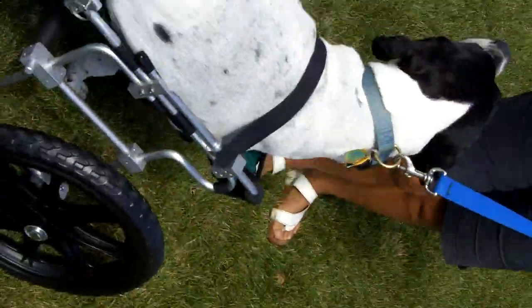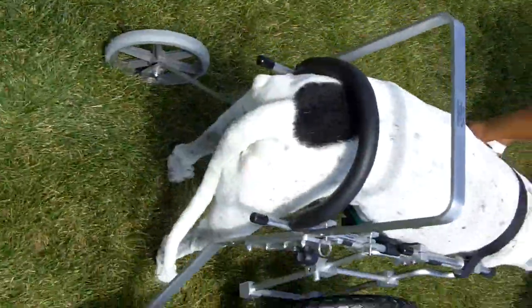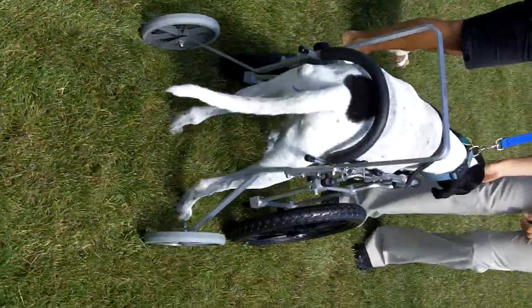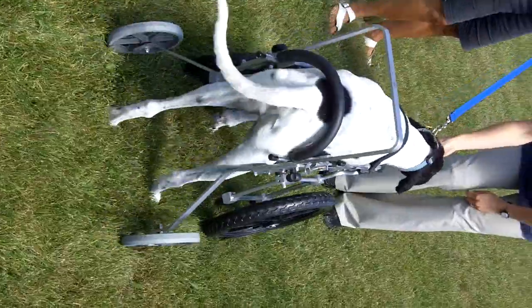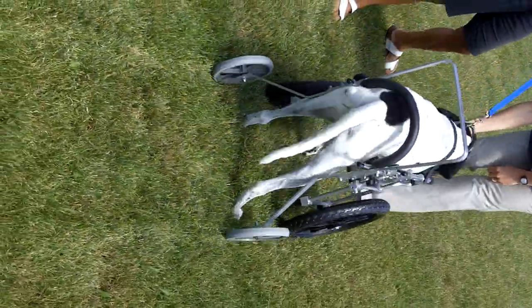And do you have a treat? Yes. So if you take the video from the rear — Chevy! Come on, Chevy. There we go. Good boy. Come on, little boy. Very good. Here, why don't I do it so you can see? Sure. I want you to see it as well.